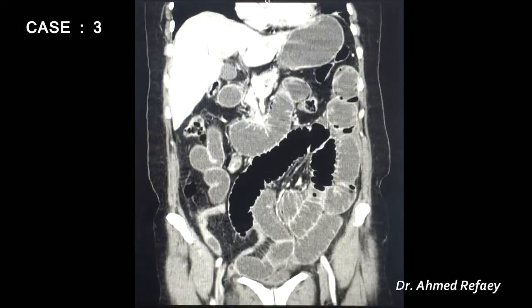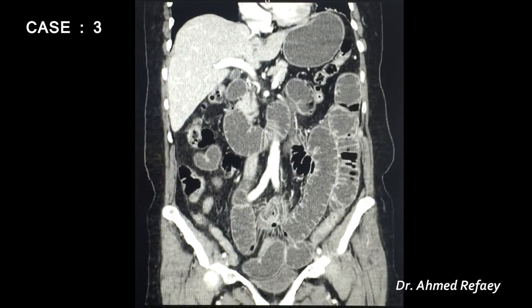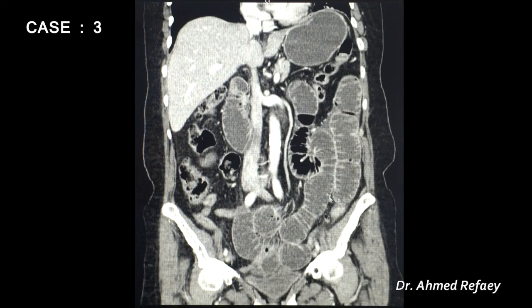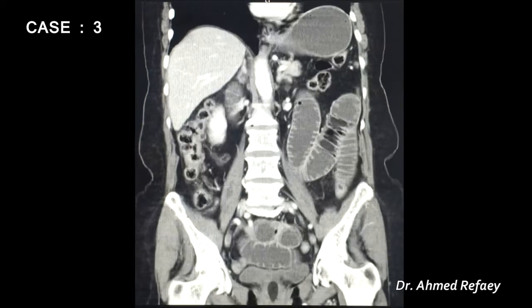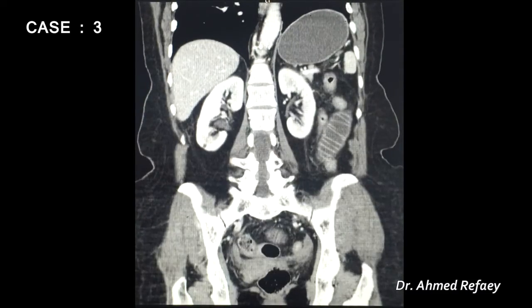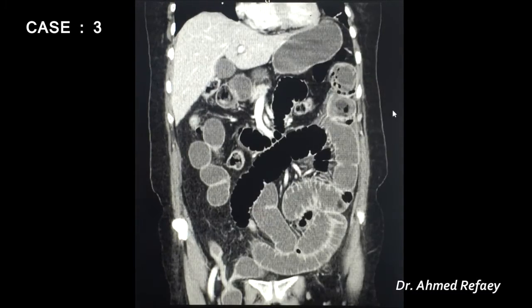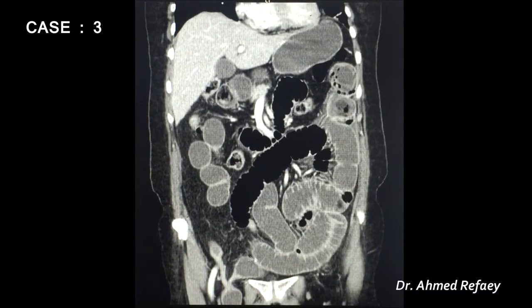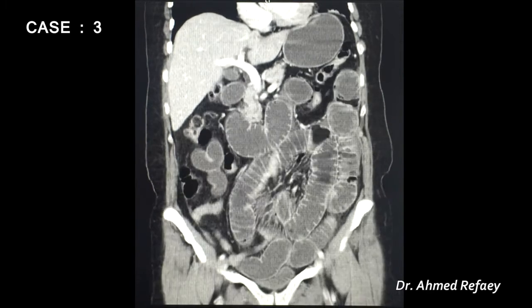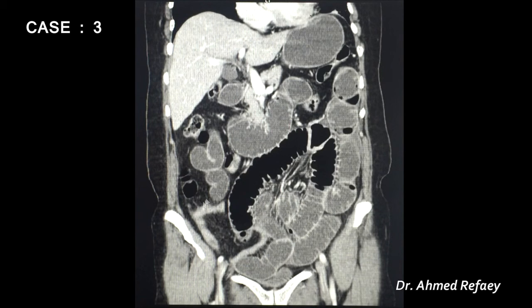Coronal reconstruction images for the same patient again show marked dilatation of the small bowel filled with fluid, with valvulae conniventes leading down to the right femoral hernia region. The transition zone is clearly visible between the proximal dilated small bowel loop and the collapsed distal ileal loops. This confirms small bowel obstruction due to right femoral hernia.